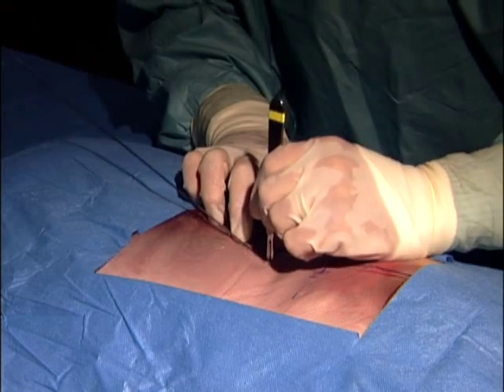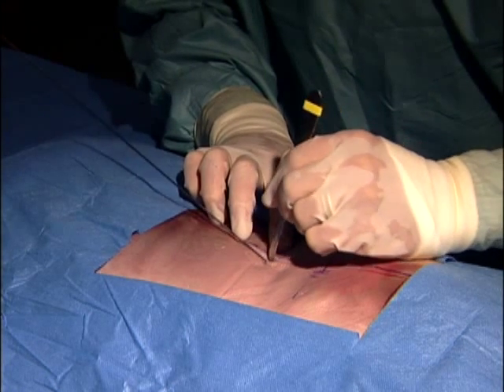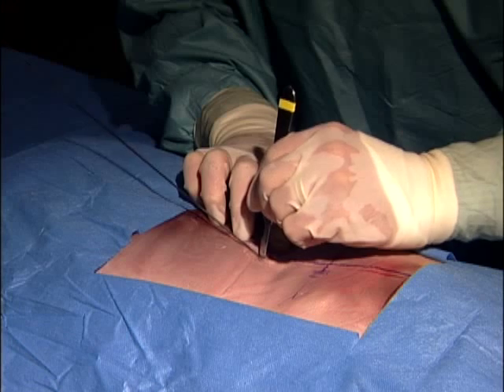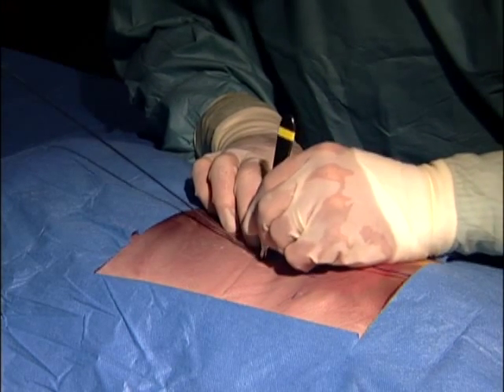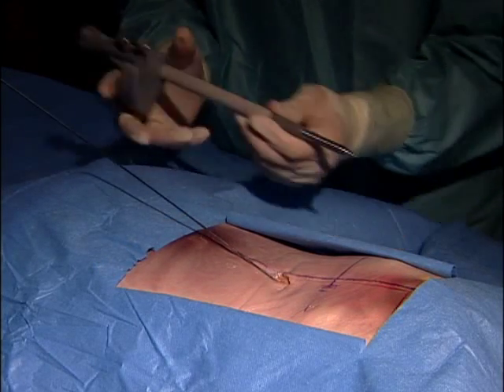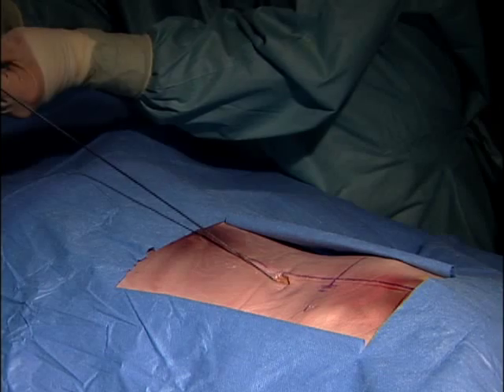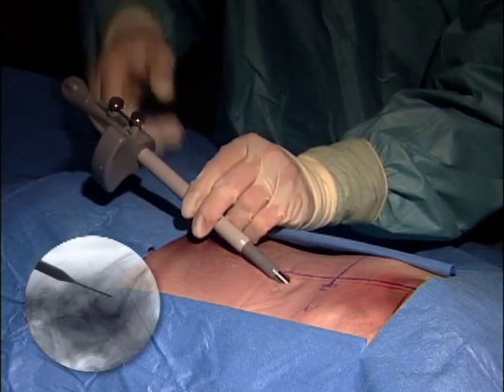Once the K-wire has been placed, make a 15 mm incision through skin and fascia. The fascia needs to be incised inferiorly to the skin incision to accommodate the teleport tissue retractor. The teleport is placed over the K-wire and advanced until the first tissue retractor comes in contact with the inferior facet. This should be confirmed in the lateral view.